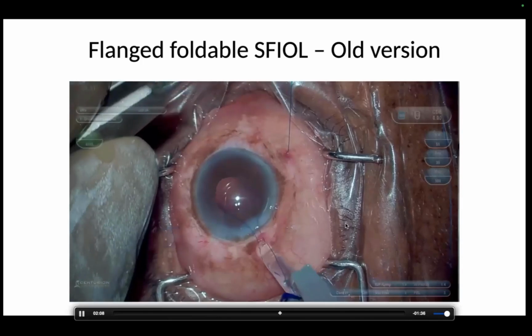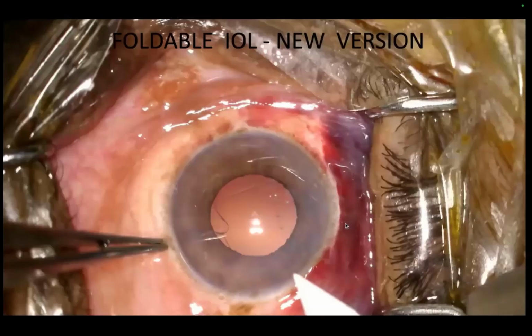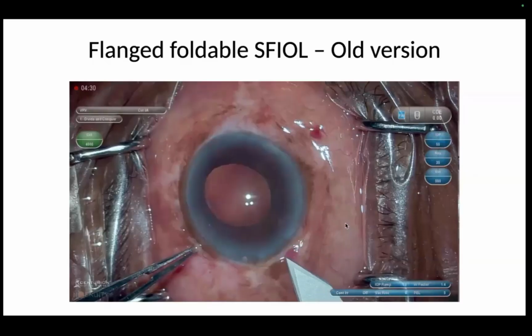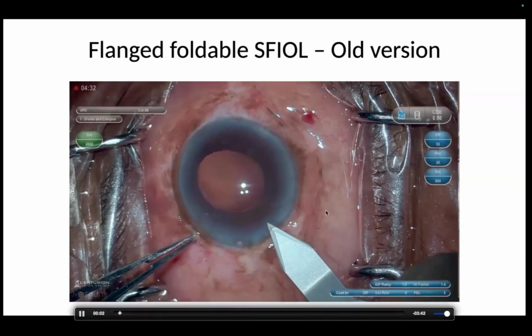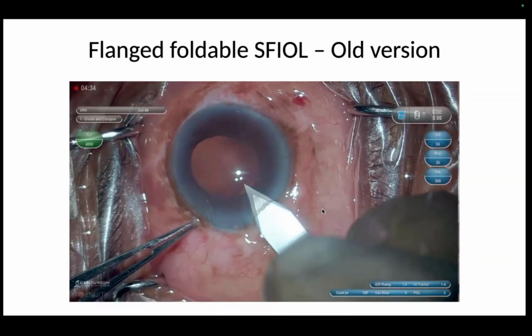So lately we've gone back to the olden days, 20 years back, when we did not have injectors for implantation of the foldable lens after phaco. What they had was a folder and holder. I've never seen it. Then I had to ask RK sir and learn from him. So there is a device called a folder, which folds the foldable intraocular lens, and then the holder to hold that, and then you put it inside the eye. So that was the practice 20 years back.